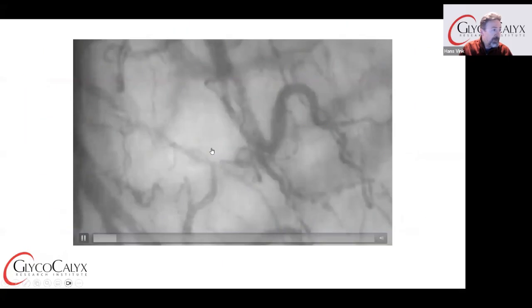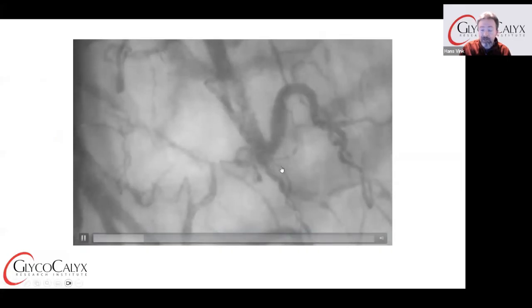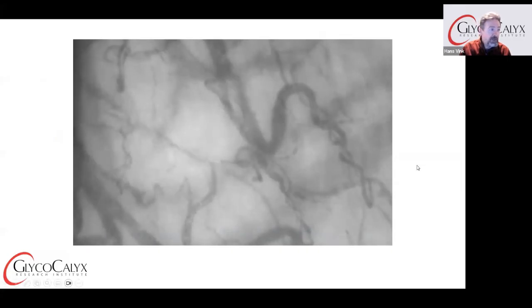Well, these are the kind of images that you might have seen by now, if you put the Glycocheck system in your mouth and see your red cells perfusing through your capillaries live. And then basically the Glycocheck measures two most important parameters, which is the number of capillaries that are red cell perfused. As I showed you before, any risk exposure will decrease the number of perfused capillaries over time. And then also a measure for glycocalyx, which I'll show you in a second.